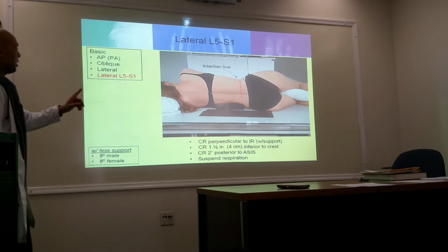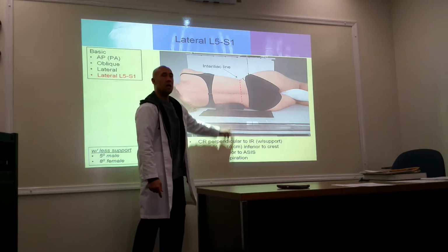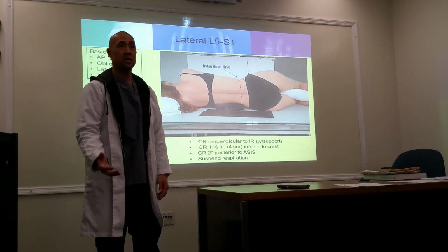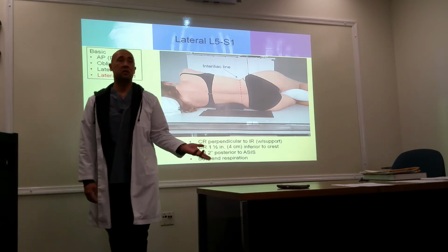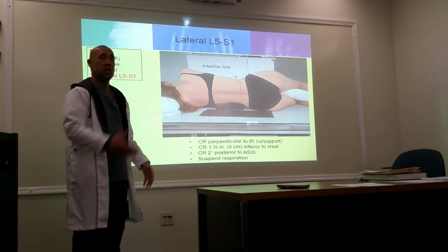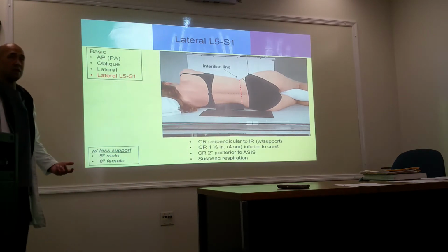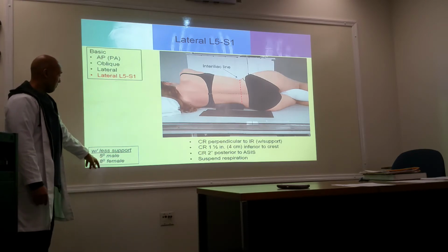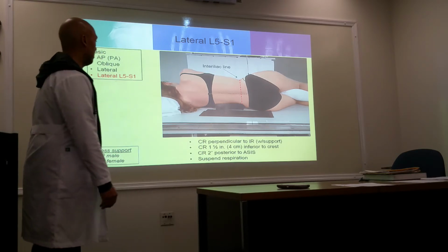All right. So it says here perpendicular, okay, with support. Are you guys using an angulation on your spot films? Always. All the time? What's your degree of angulation? About 5 degrees, okay. So again, this is also based on body habitus or if they're male or female. Females have larger hips, which is going to cause the hips to dip a little bit more. So you're going to use greater angulation. So your angulation then, if not perpendicular, is going to be anywhere between 5 to 8 degrees. Okay, it's going to be greater with females.